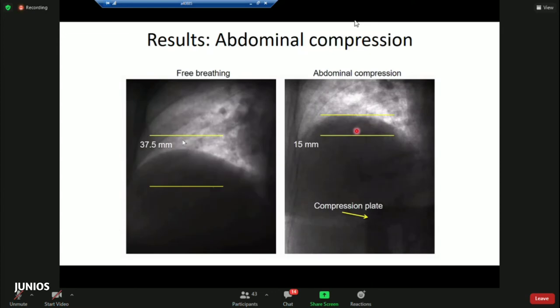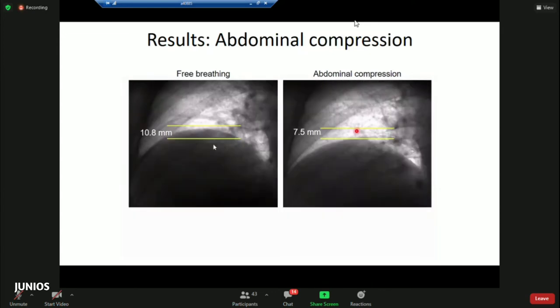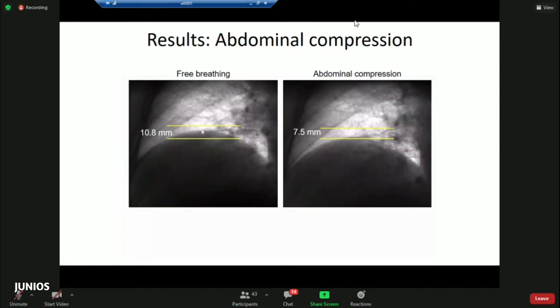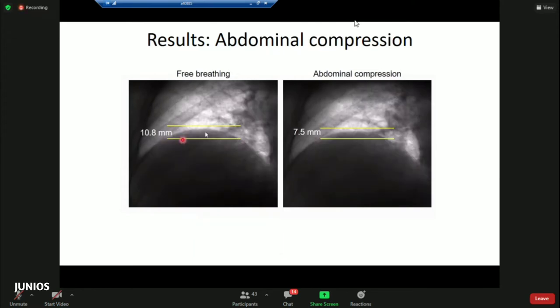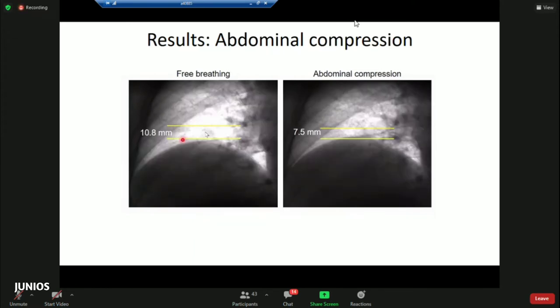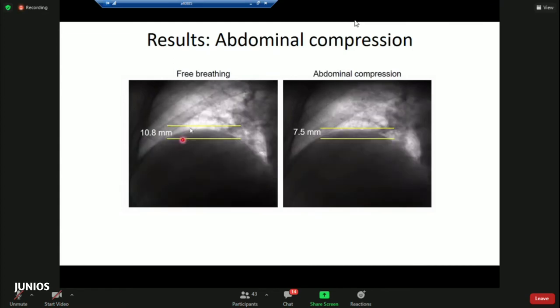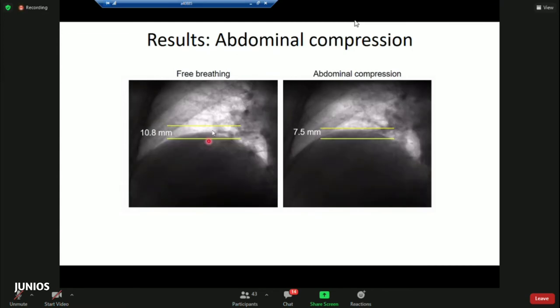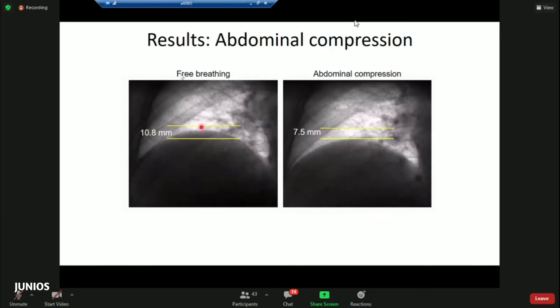It takes longer to treat, but whenever the patient hits the exhaled spot in free breathing, the beam can be on. That's the next option if the patient cannot perform exhale breath hold. Some patients cannot really go to a stable baseline in terms of exhale position. So in that case, the patient cannot really do the free breathing gating option.